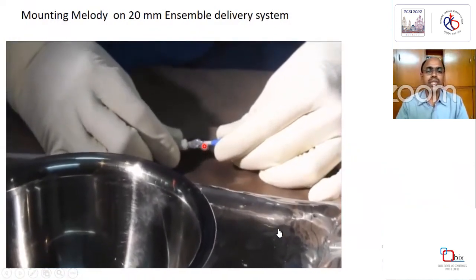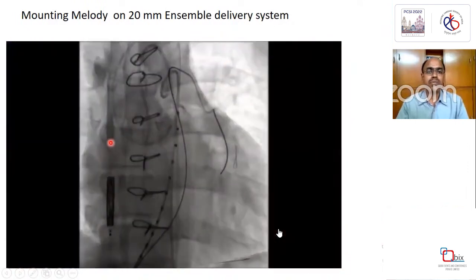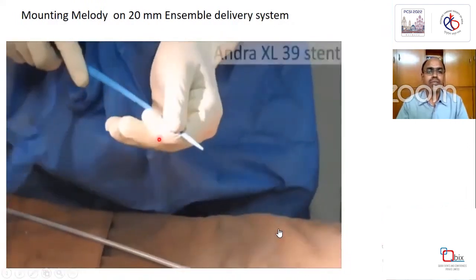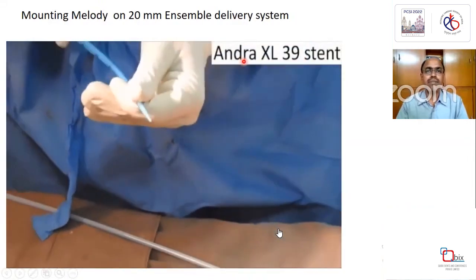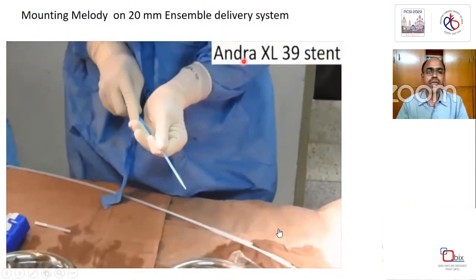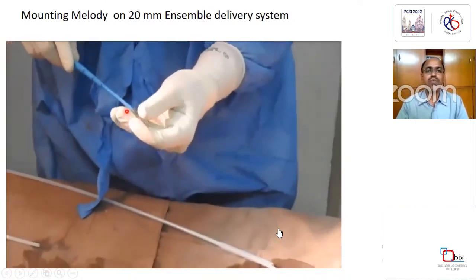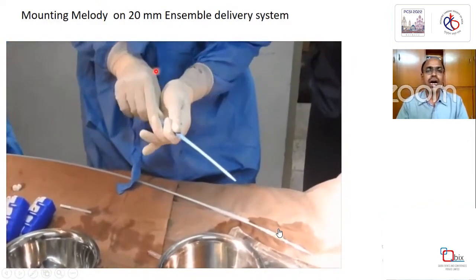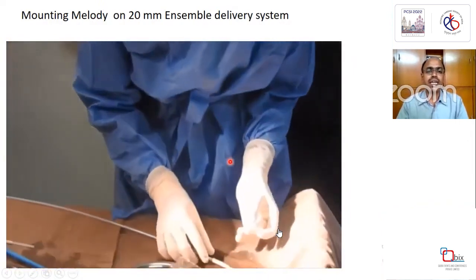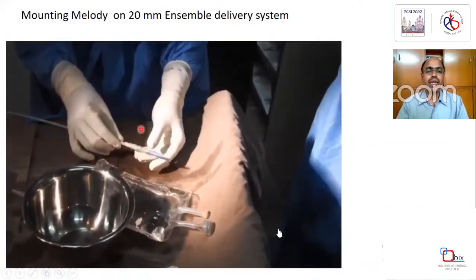So in order to do the pre-stenting, what we did subsequently was remove the Ensemble system again, and we loaded an Andra XL 39 millimeter stent. Initially it was dilated using a 14 French dilator, and once the Andra XL had a sufficient lumen, we mounted it around the Melody valve.